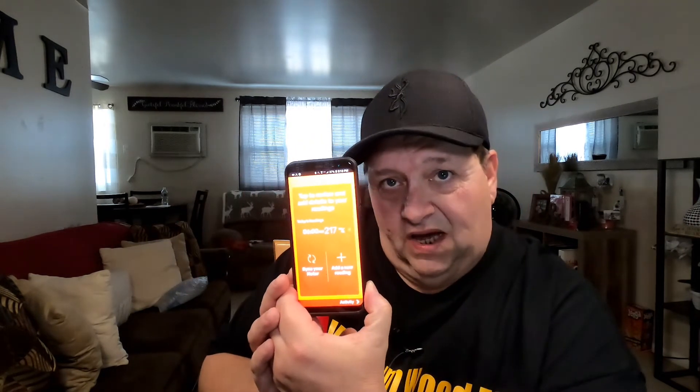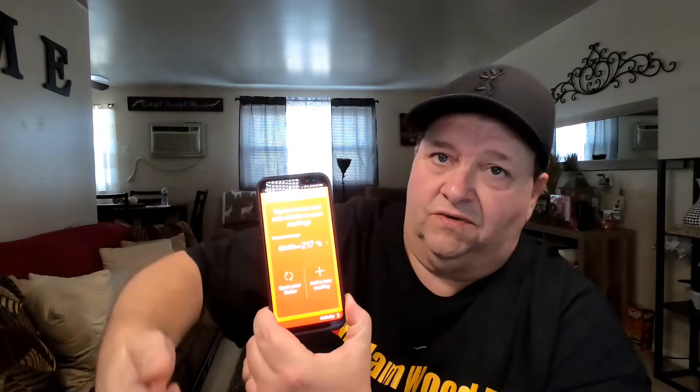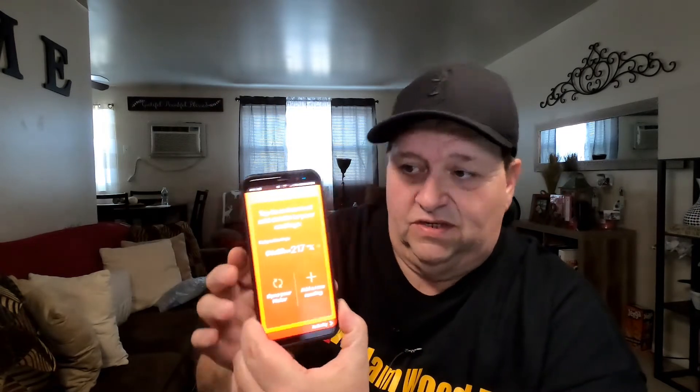This morning my level was 217, which was kind of high. You'll notice the screen shows red or orange — that's an indication your levels were a bit high. For most people, levels are usually high first thing in the morning, so it's going to look this way unless you just don't have that problem.